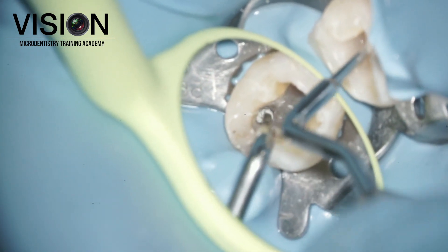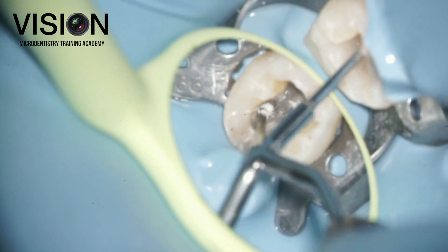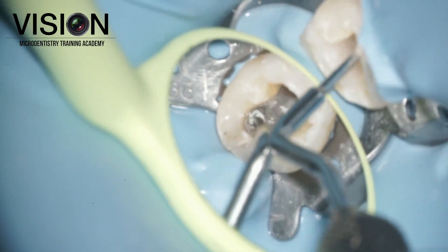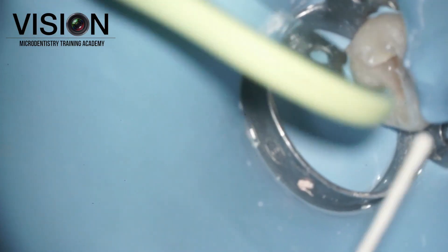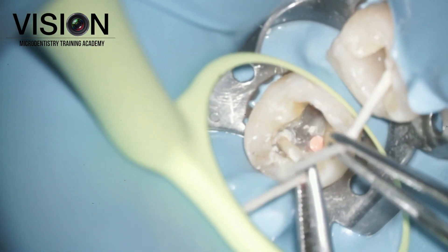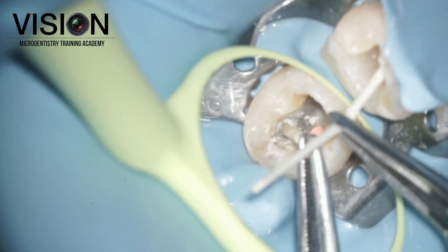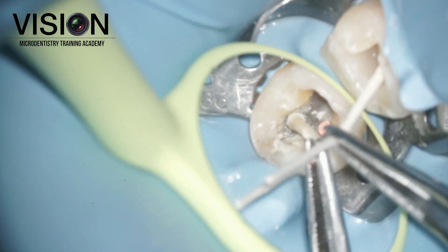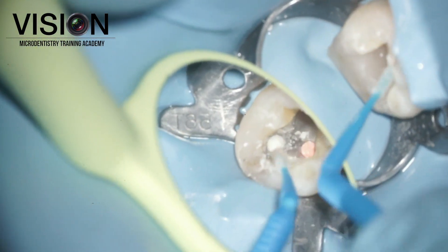These increments were placed one by one — roughly four to five increments — and compacted using a plugger. Once that was done, we used a paper micro point to blot out the excess moisture, and any small particles of MTA present in the pulp chamber were removed using a micro brush.